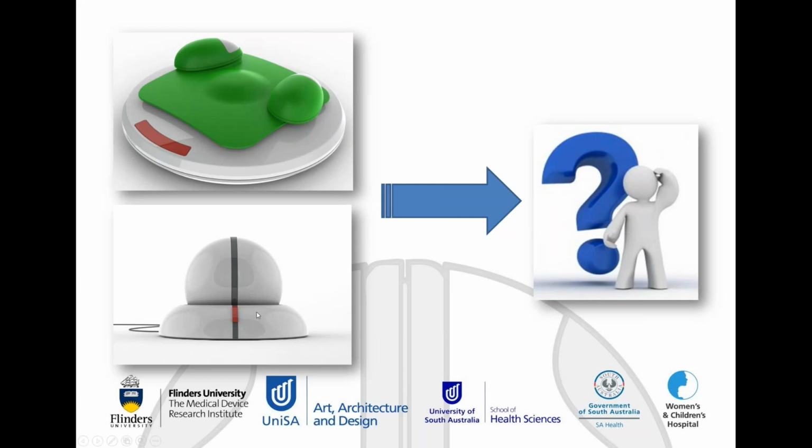The bottom controller here picks up on that sphere or orb-looking controller from before. You can see it's got a wide base as well, and effectively you put your hands on the controller and you rotate it around to use it as you need to control it. I just want to highlight that both of these controllers have this red button here. You can see it on this controller here, and what we call this is an out-of-game button.